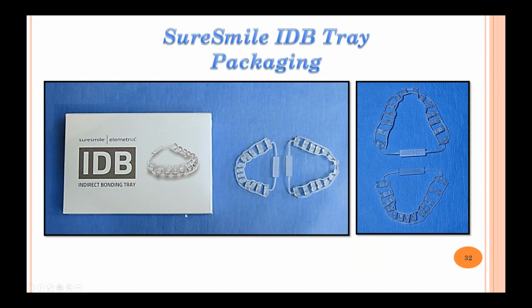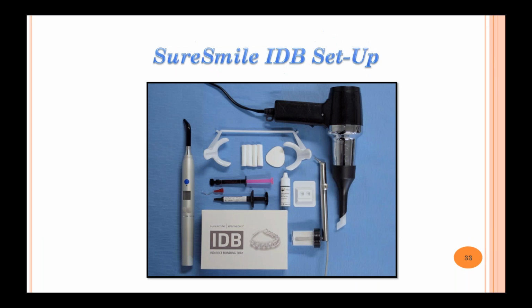Okay, so this is SureSmile's indirect bonding packaging as well as their trays. It's a small box, very different from, remember those big boxes from Invisalign way back in the old days. Very small box, so minimal space requirements. Everything is labeled very clearly on the front of the box. And if you ever get a chance to get a feel for these trays, they have some flexibility, but they're very rigid. So when they're seated, they hold that bracket very precisely.